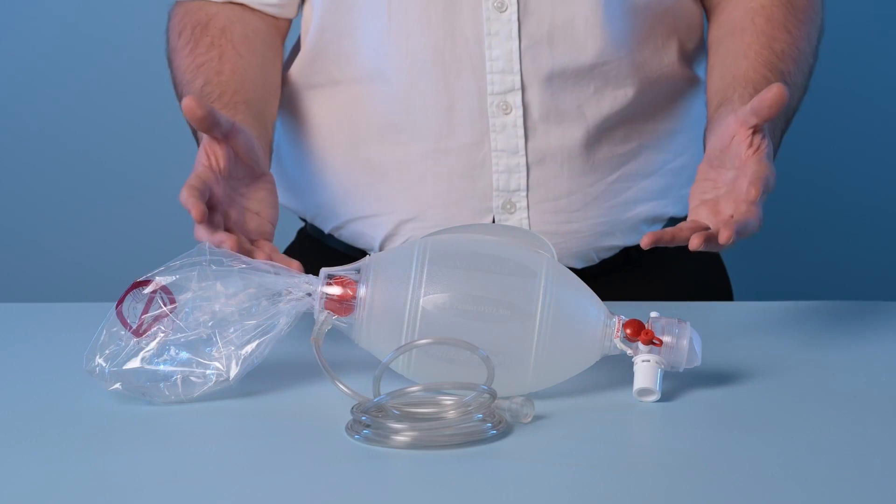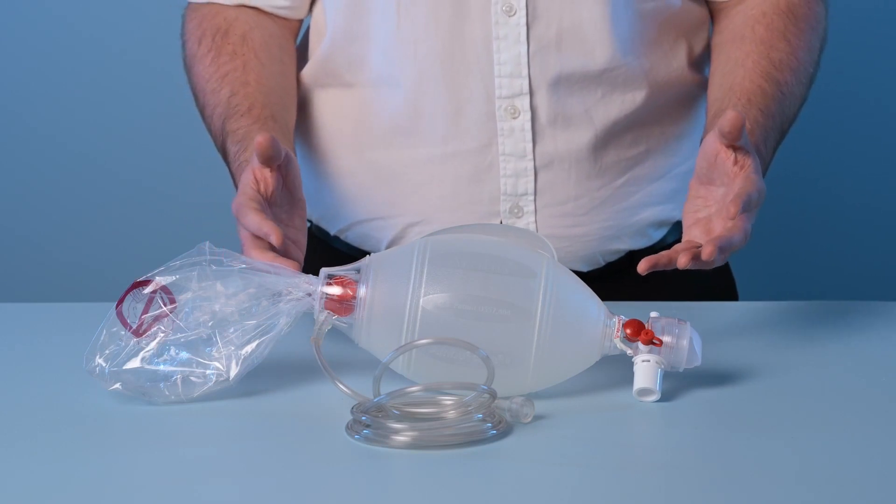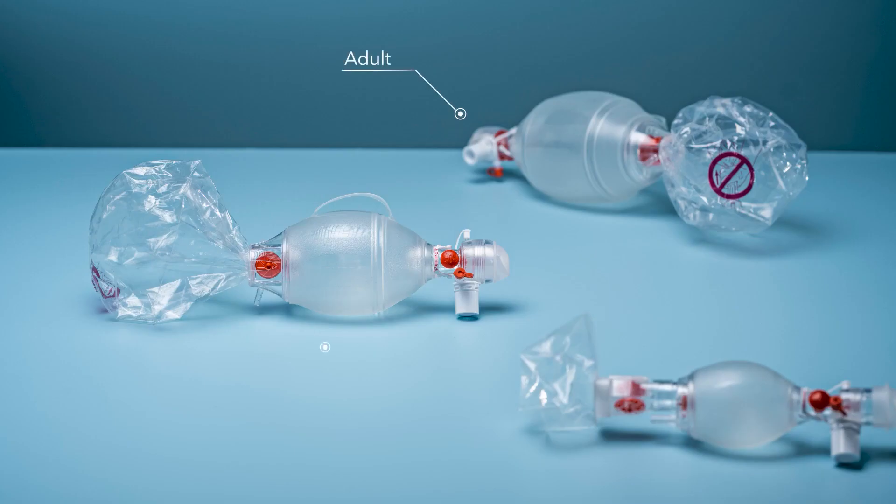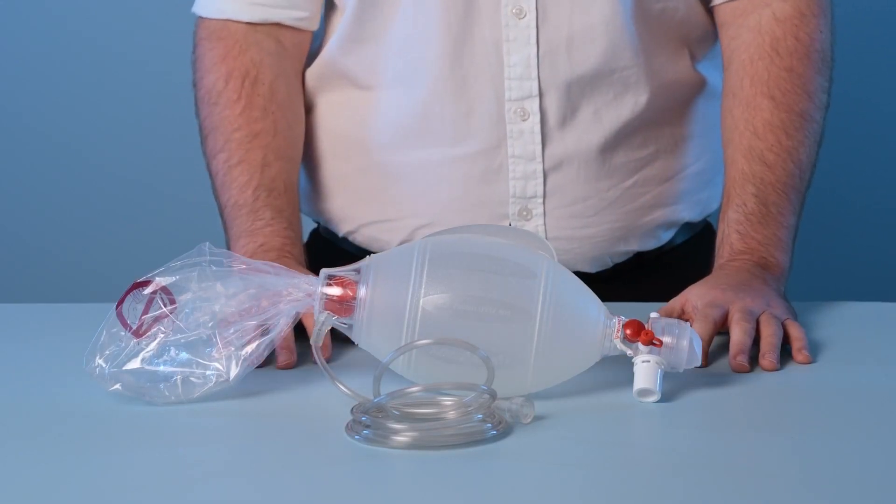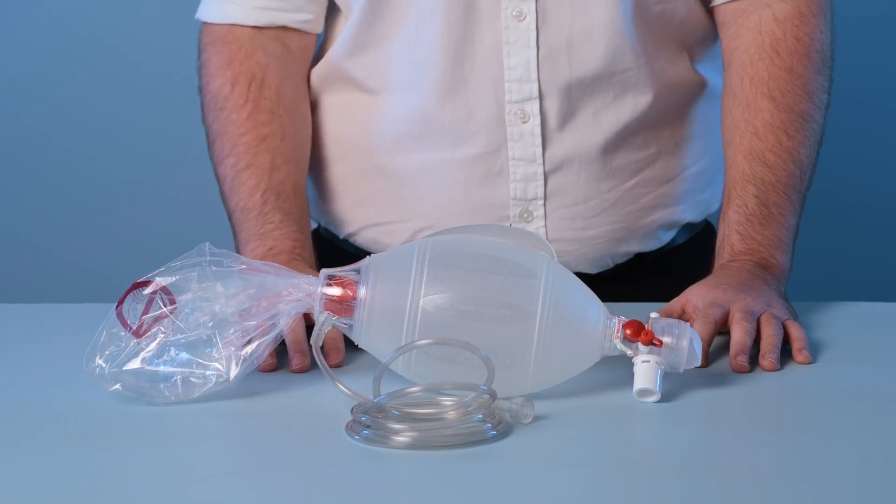The Spur2 is a disposable resuscitator that is available in three sizes: adult, pediatric, and infant. It's available in a range of kits featuring various accessories including face masks of differing sizes, PEEP valves, and manometers as well.